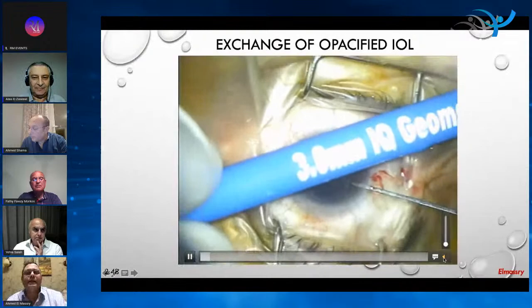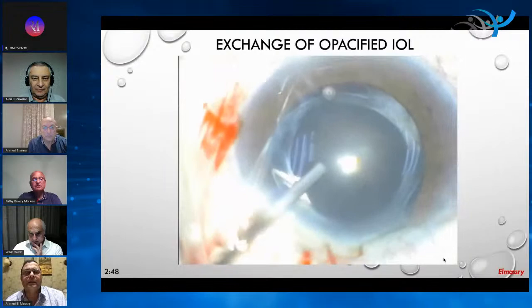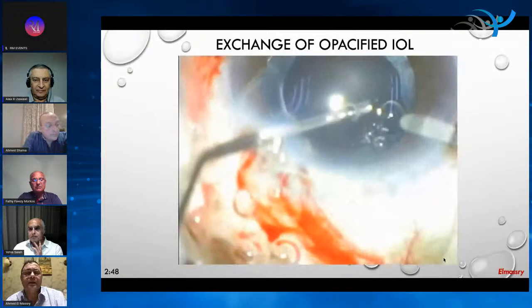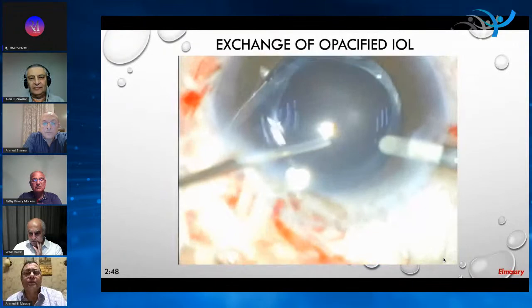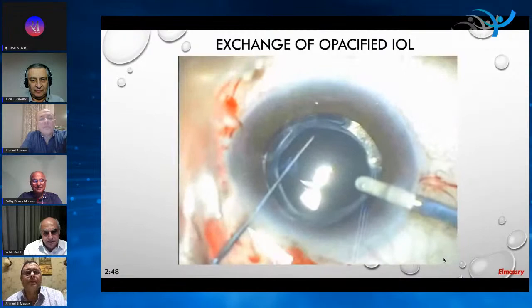And this is the second case, of an opacified IOL. We see opacified IOLs, and many surgeons ignore them or think it is opacity in the posterior capsule and not an opacified IOL. This patient was referred to me for doing YAG laser. She was the aunt of one of our colleagues, who did her cataract about 2 years ago. And you see how the IOL is adherent to the capsule. You have to be very gentle in these cases because these adhesions should be relieved to free the IOL from the bag.